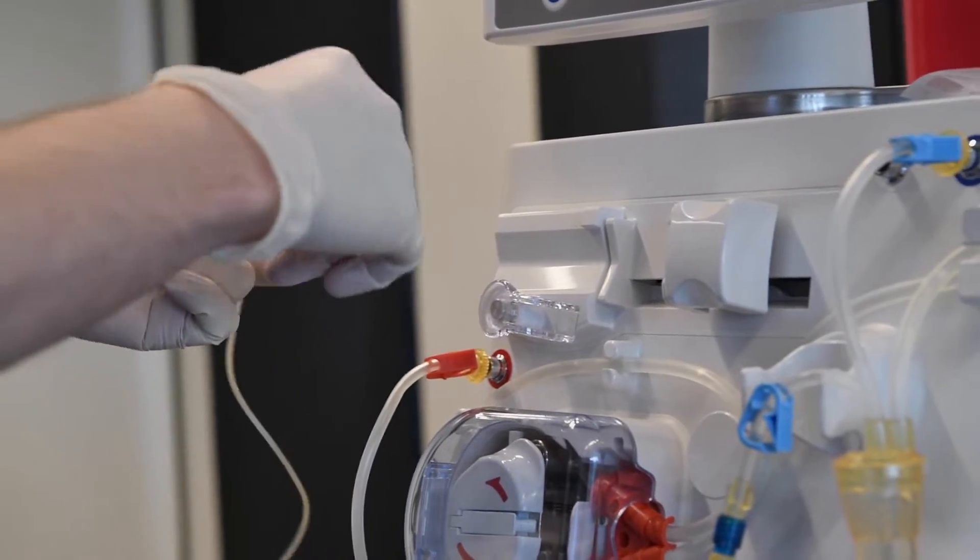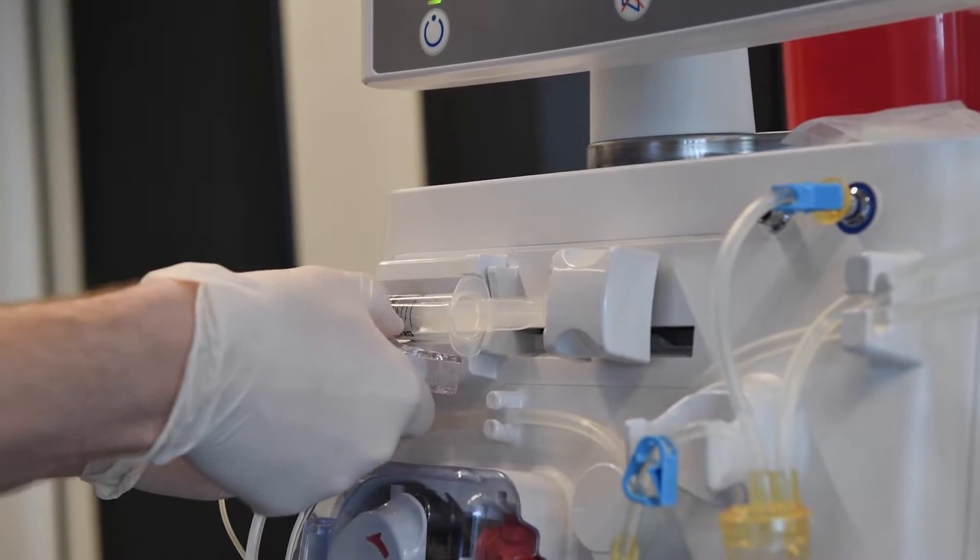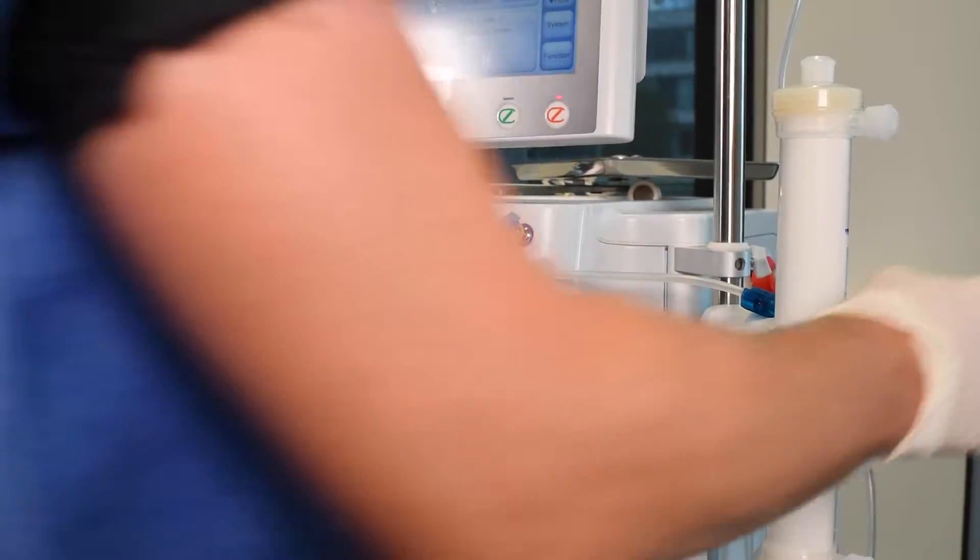If heparin is used, connect a syringe to the heparin line and place it in the heparin pump. Simply press the pusher to move it and secure the syringe with the syringe stopper.